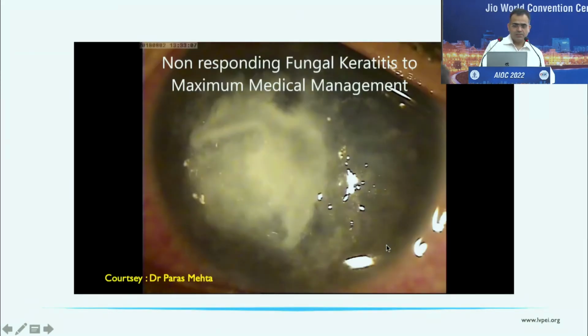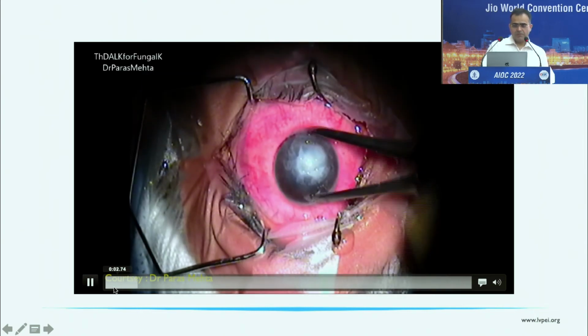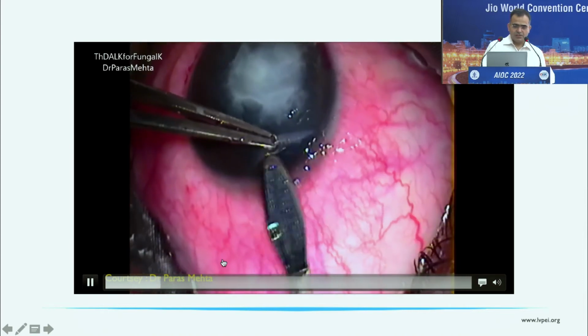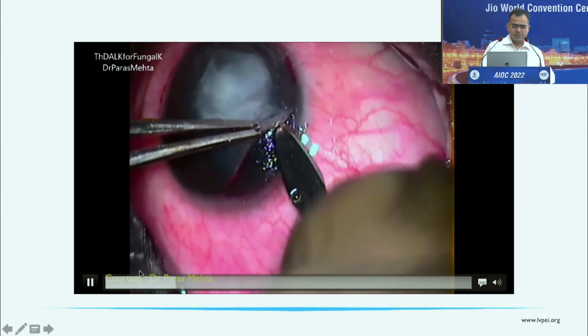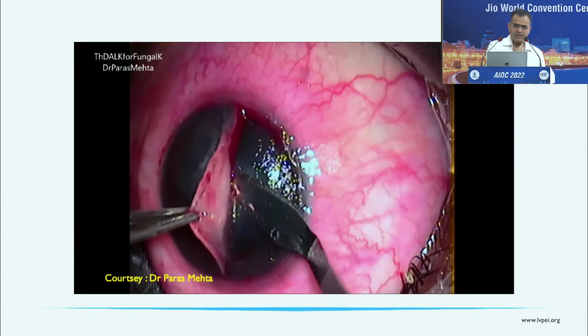So I think lack of time, I will just show this video from Dr. Paras Mehta. She performed for fungal keratitis. Usually this is not a very obvious indication for performing DALK, and in literature only few cases are reported, particularly from Z et al. group, and those are basically very, very early fungus infections, particularly in cases of fusarium keratitis where it doesn't go so deep. You can still get away with performing layer by layer and going ahead.